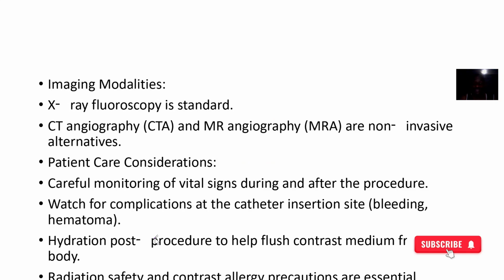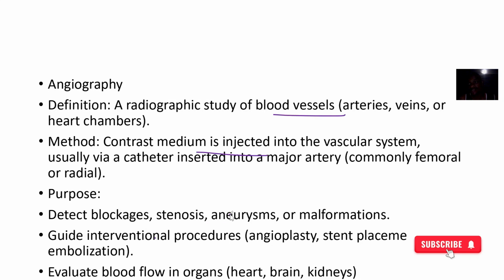You can also use X-ray fluoroscopy, CT angiography, and MR angiography. Make sure that you are monitoring vital signs during the procedure, and always watch out for any complications that come as a result of catheter use.